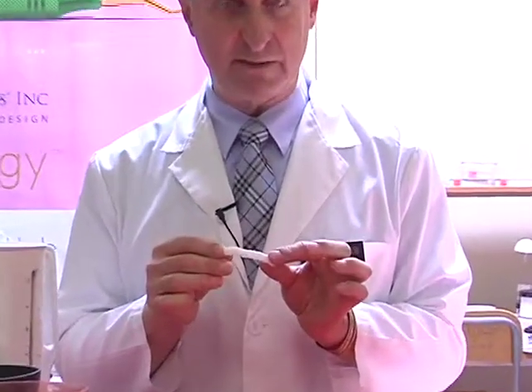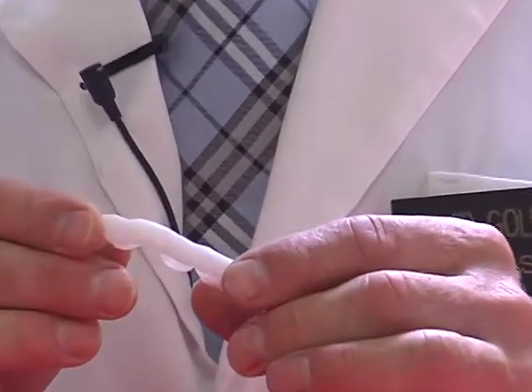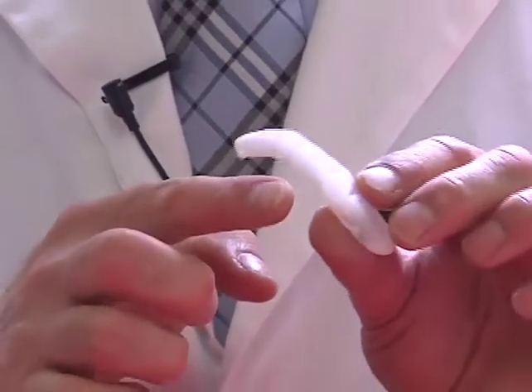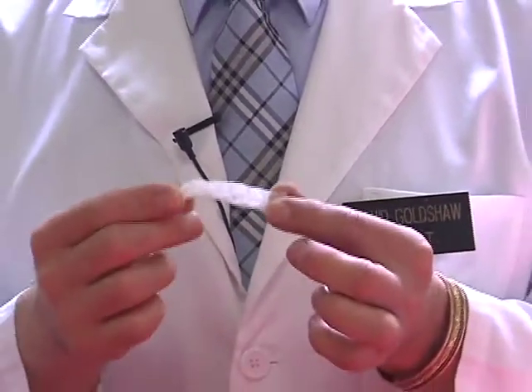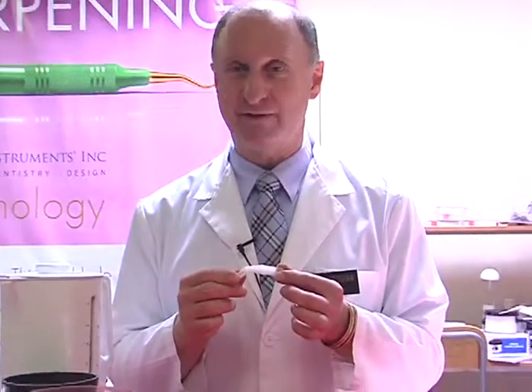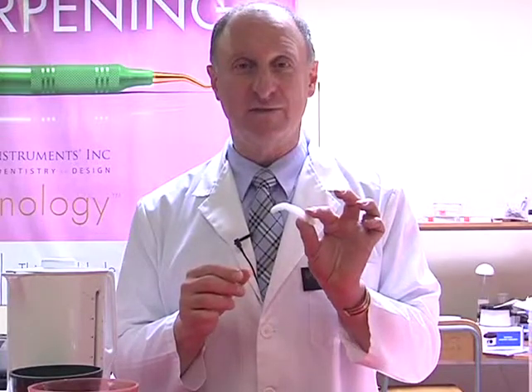We can trim this with a scalpel blade, with some scissors, or even using a straight handpiece with a cross-cut rosehead burr on there to trim in between. And that's how to make a bleaching tray inside the mouth immediately. The whole system is very fast and very convenient. It's going to run you about $2.40.